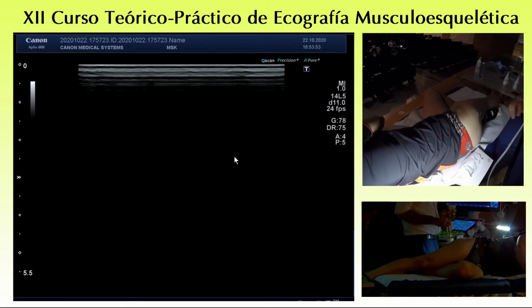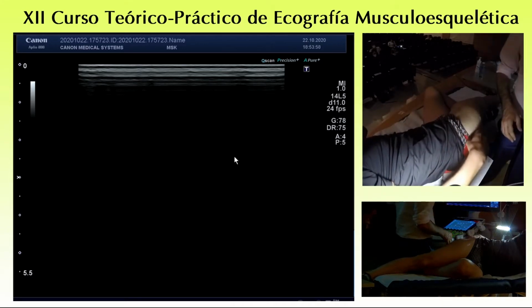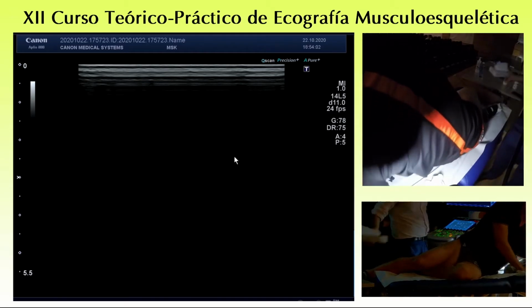Now we check if you don't have other questions related to the lateral hip. We check the piriformis, and even though we have seen that there is not much pathology to see about that, it is just to recognize it, maybe for injection.